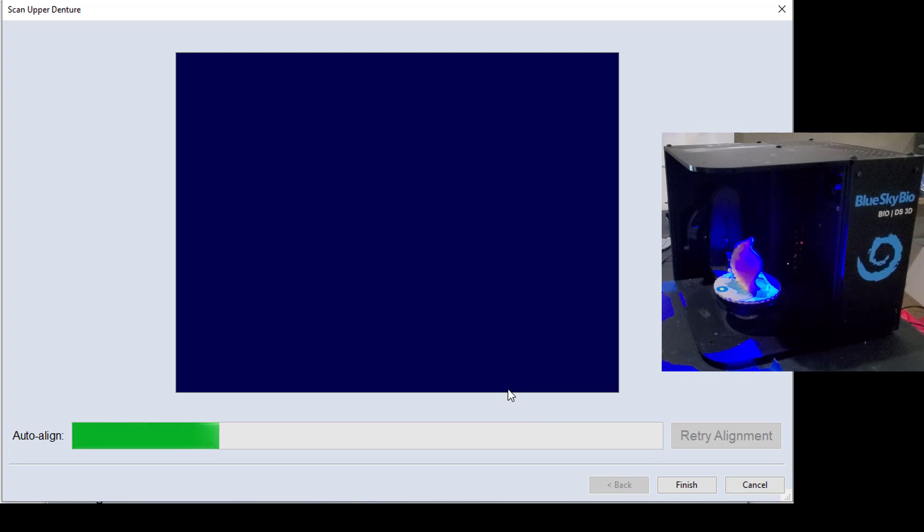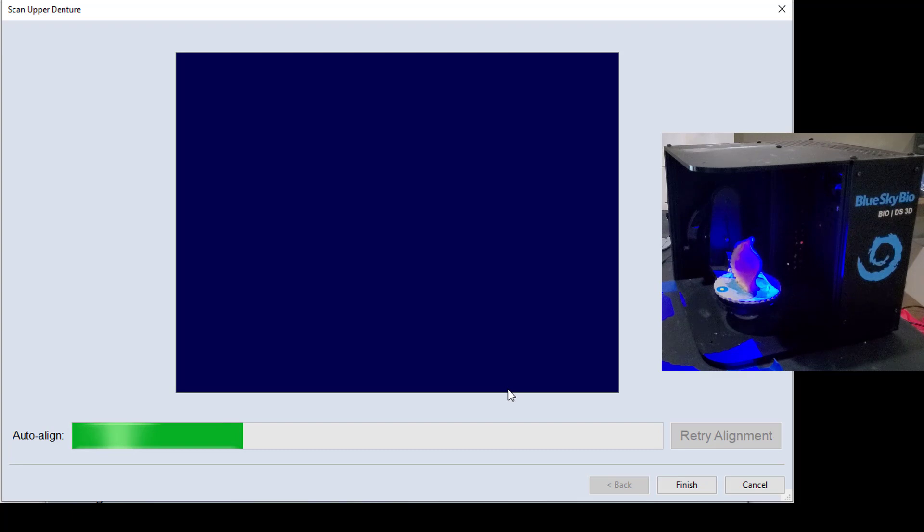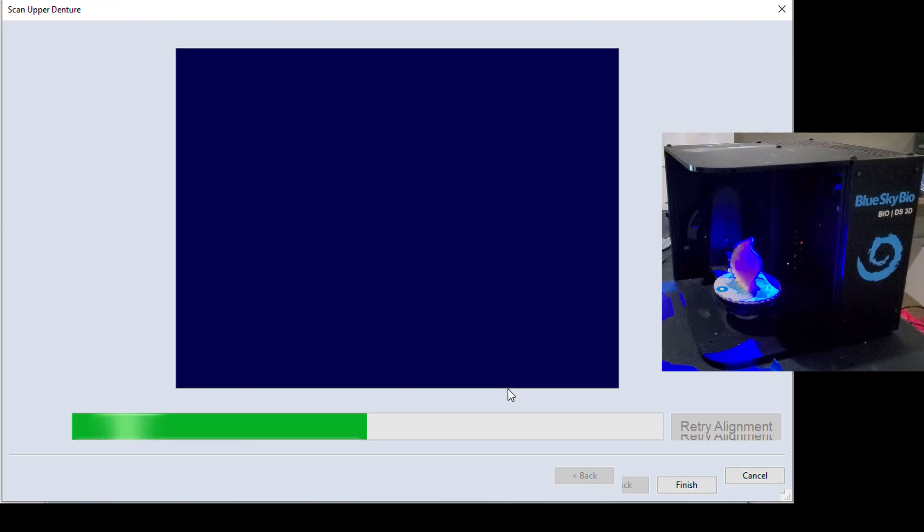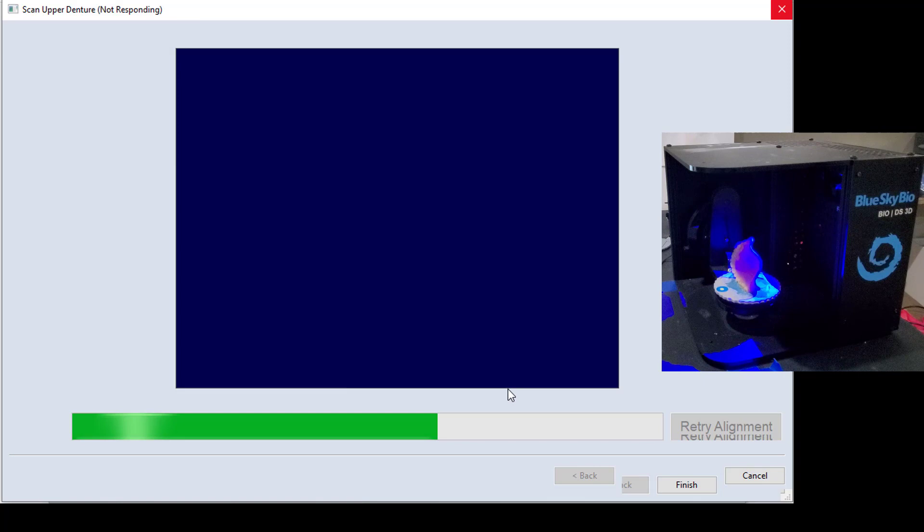So this next step, once you click OK, the software is going to automatically align it. So it's going to use the common data in the palate and the lingual of the teeth, all the areas that were common to both scans, and it's going to stitch those together and then turn this into one model.